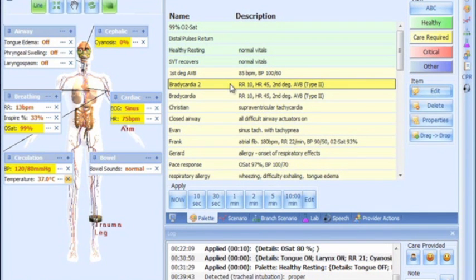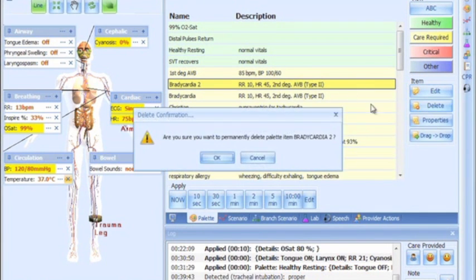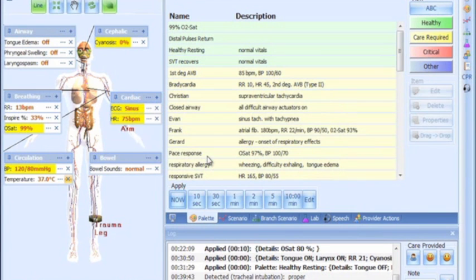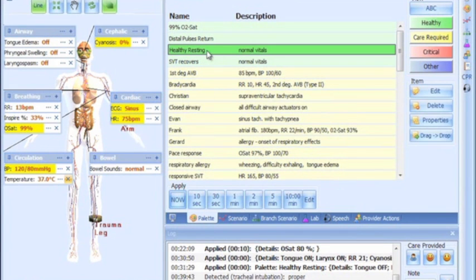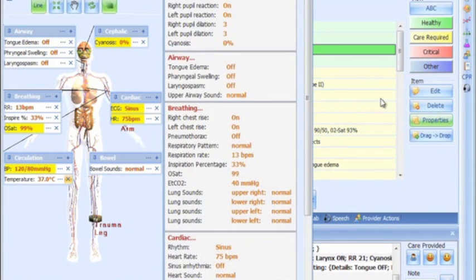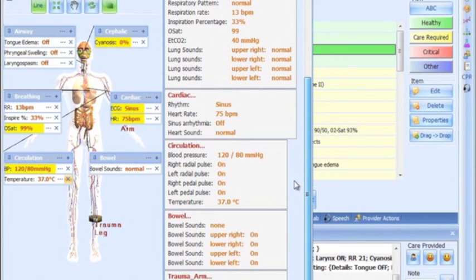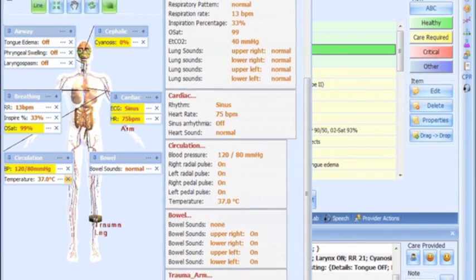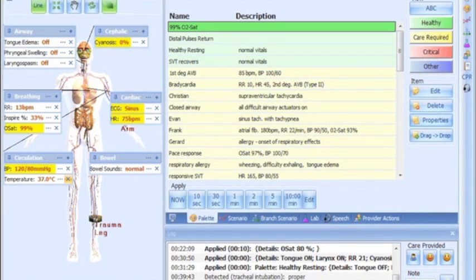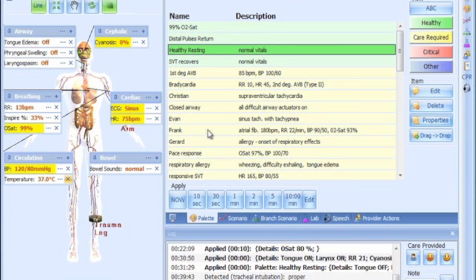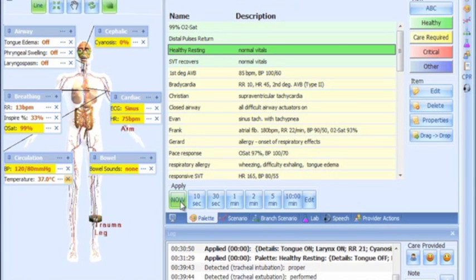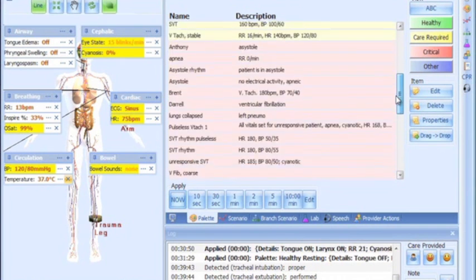They can also be deleted permanently or checked for properties with a simple touch of the stylus. As with the details, the palette items can be applied or saved to a scenario from the Scenario tabs.